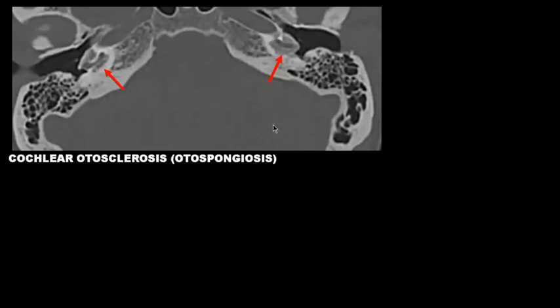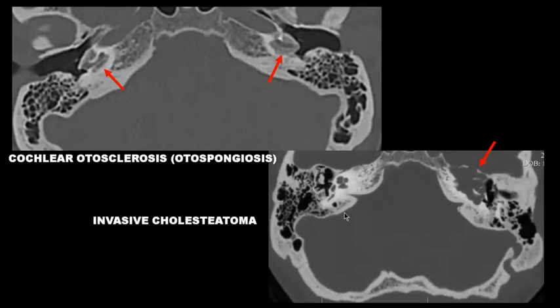Later in the 80s, we learned to diagnose cochlear otospongiotic changes as well as its mimics, such as osteogenesis imperfecta and, in this case, invasive cholesteatoma.